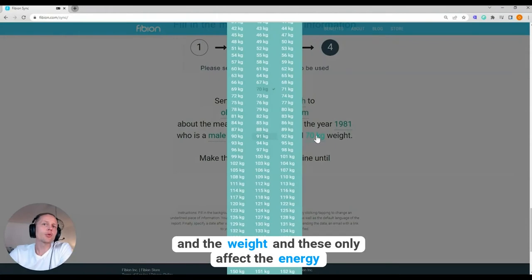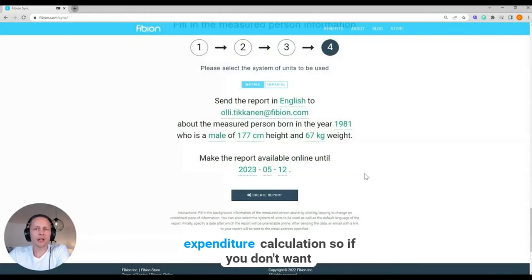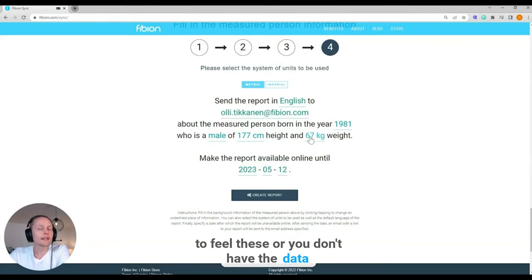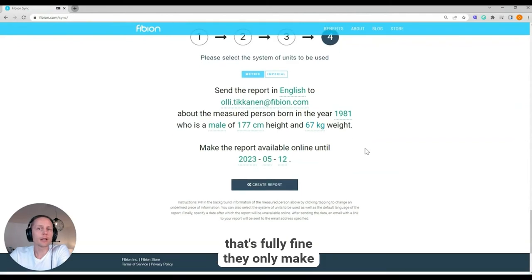And the weight. And this only affects the energy expenditure calculation. So if you don't want to fill these or you don't have the data, that's fully fine.